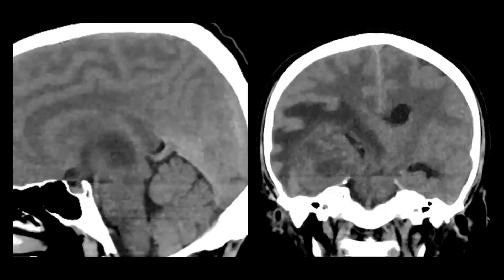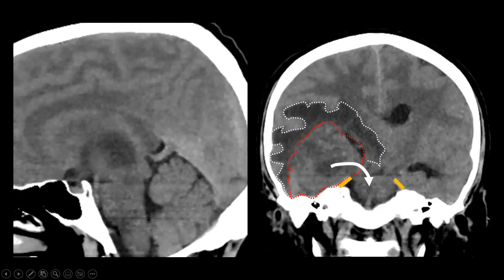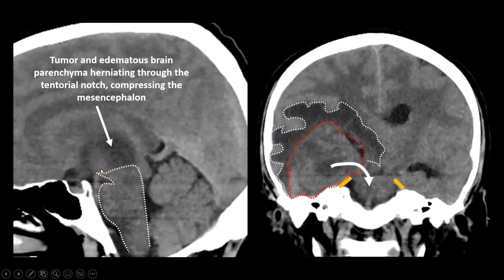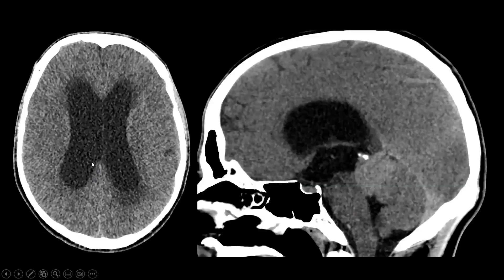In the coronal plane we clearly see the brain tumour surrounded by oedema, and the tentorium cerebelli — brain tissue is herniating above the tentorium through the tentorial notch and compressing the brain stem. On sagittal images, where you should see the mesencephalon and third ventricle above it, instead we see oedematous brain tissue and tumour that have herniated through the tentorial notch, compressing the mesencephalon — another example of transtentorial herniation.